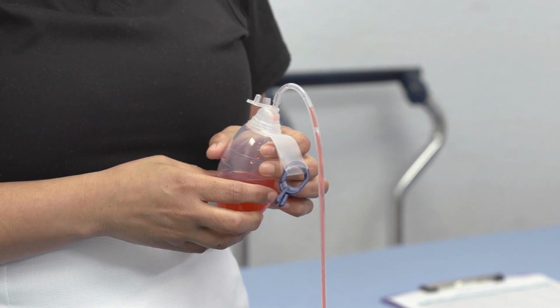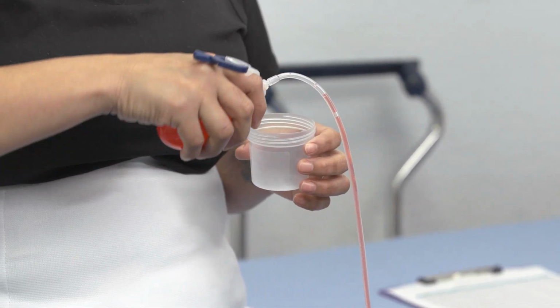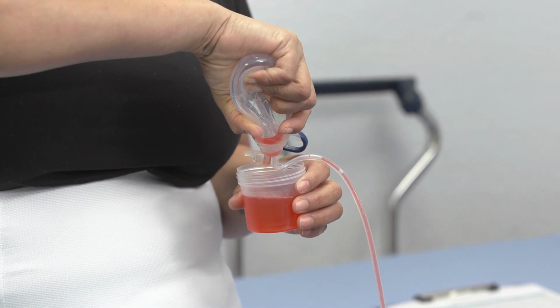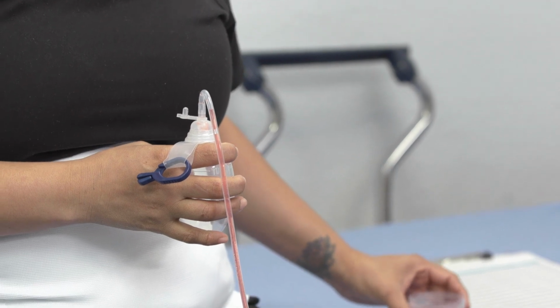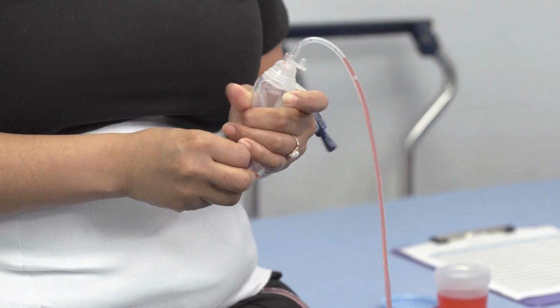Once you have removed the lid, you are then going to grab the measuring cup. You are going to tip the bulb over and gently squeeze the fluid out into the measuring cup, ensuring that all the fluid comes out. However, if there is a tiny bit in the bulb after done, that is okay. Once you have finished draining the bulb, you are then going to set that cup aside somewhere that it will not spill.